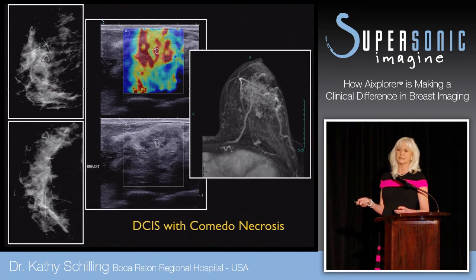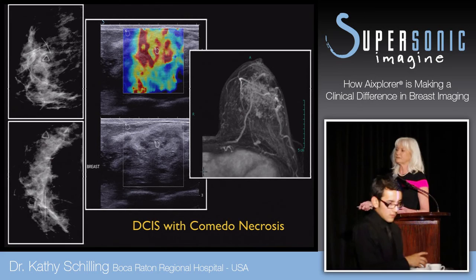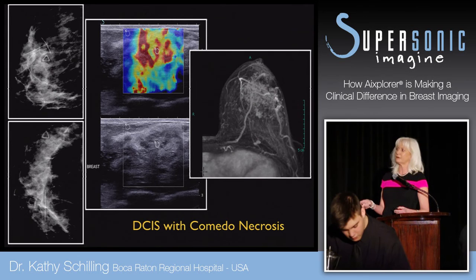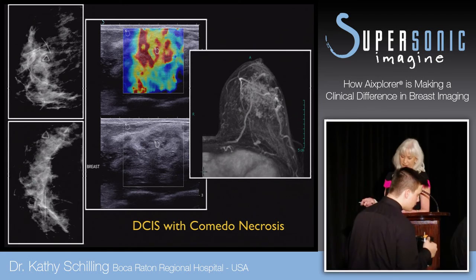We use shear wave and you can see the extensive area of marked stiffness in the tissue. This was biopsied and found to be DCIS with comedo necrosis. When we do our MRI, you can see the extensive involvement of the disease in this breast here. But certainly nothing was suspected mammographically. Something indeterminate on ultrasound, but clearly when we have shear wave, we know exactly what we need to be doing with this lesion.